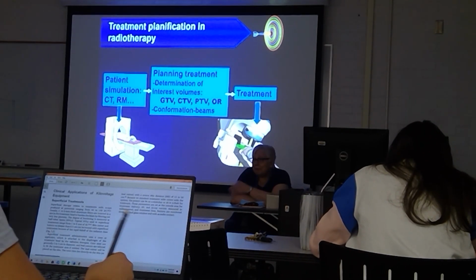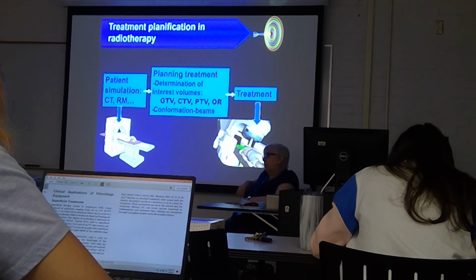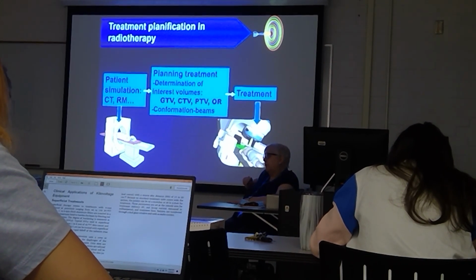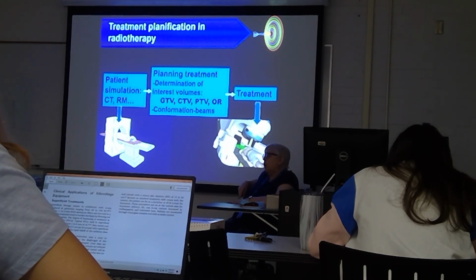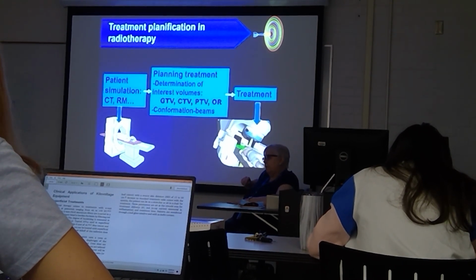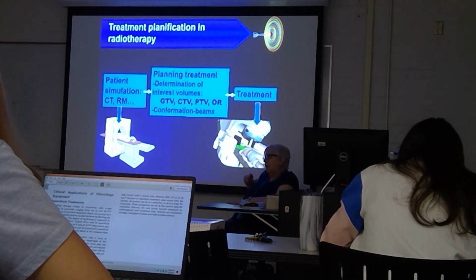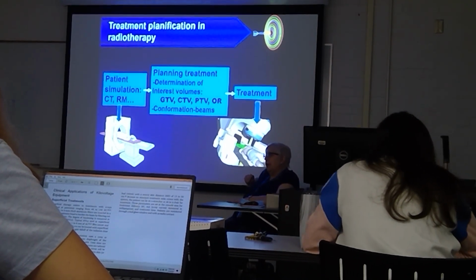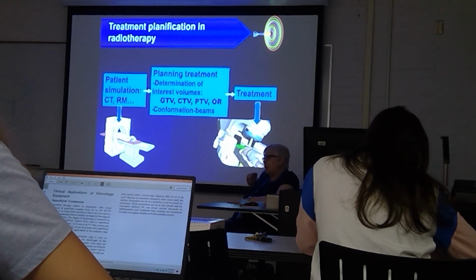I still don't understand the question. You pull it out and make sure that the filters are the correct size, and then they push buttons in the room that I don't push, so I don't know. You're talking cone beam CT. Most of ours use the KV imager. Would you be doing an AP and a lateral film?